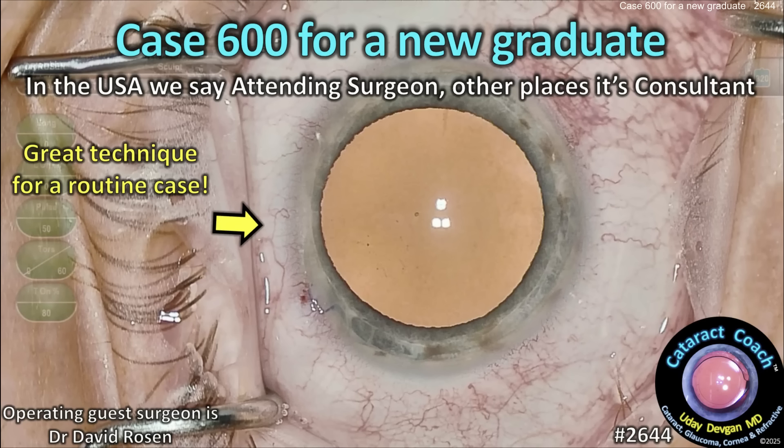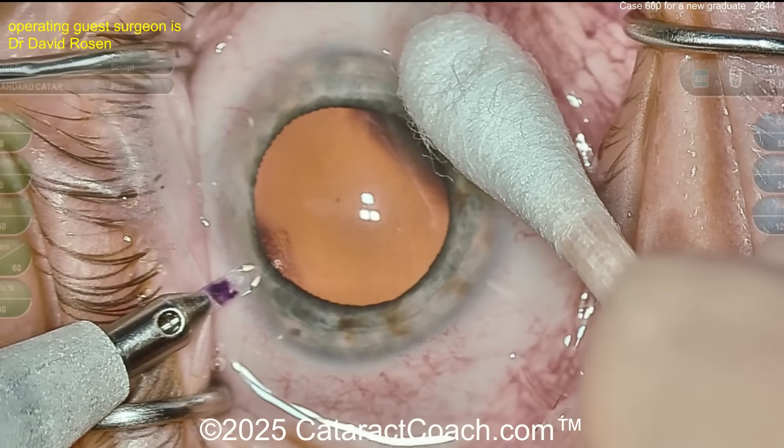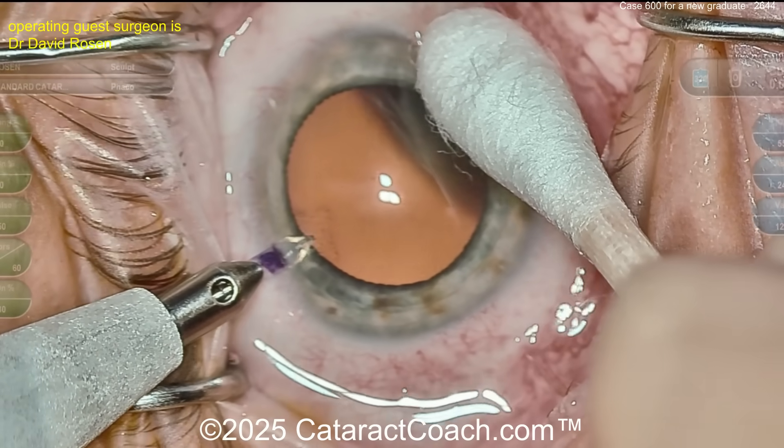CataractCoach.com, case 600. For a new graduate in the USA we'd say an attending surgeon; in other places you'd say it's a consultant or consultant surgeon. Let's watch the case here, unedited, routine case — case 600. That's pretty good; that's more than halfway up the learning curve.